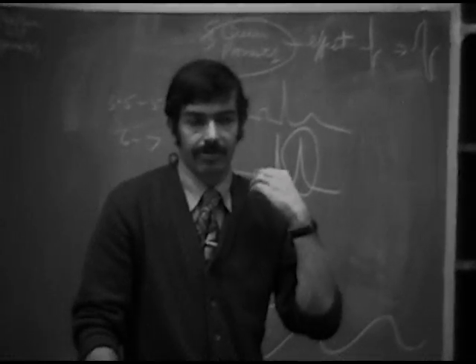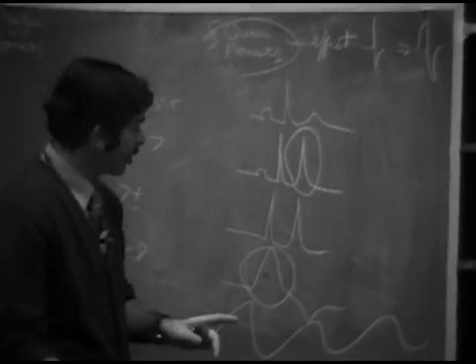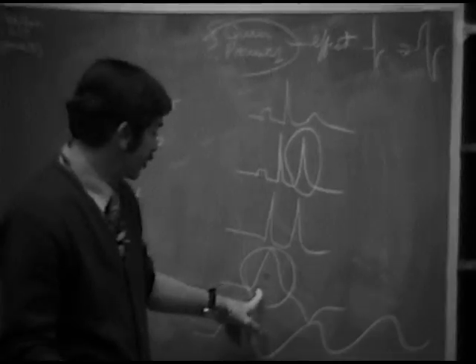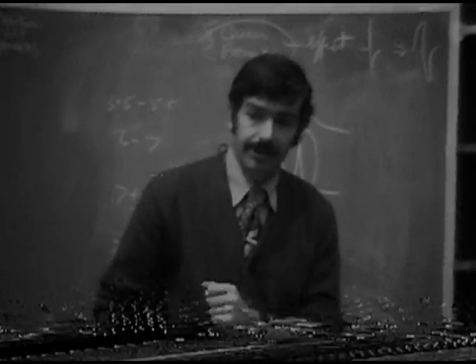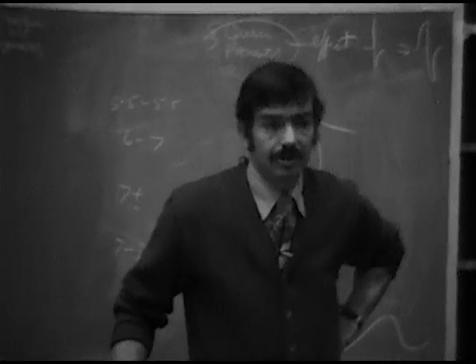So anytime you see that situation, especially with no prior history of heart block, or a patient who's recently been in normal sinus rhythm, just think to yourself, I wonder if this patient doesn't have hyperkalemia, and try to anticipate the possibility. That's the other differentiating point: in this type of situation, the rate is usually normal, whereas in complete heart block with idioventricular rhythm, the rate is usually fairly slow, 40, 50, or 30.